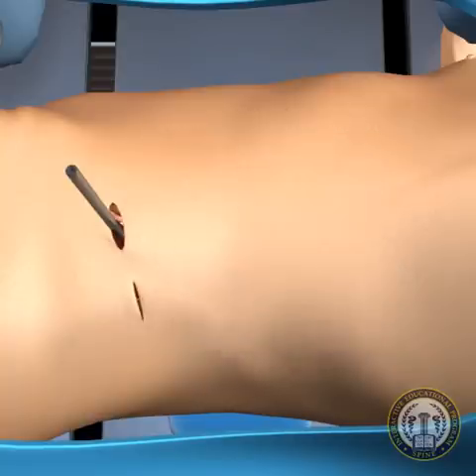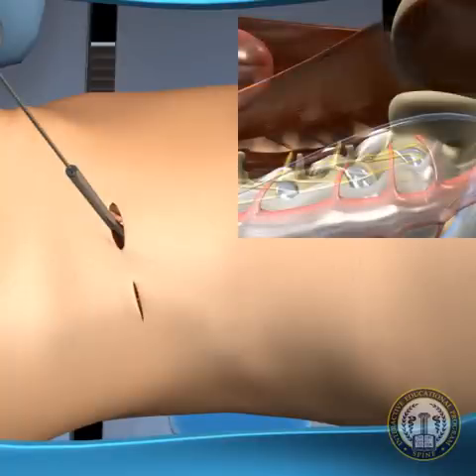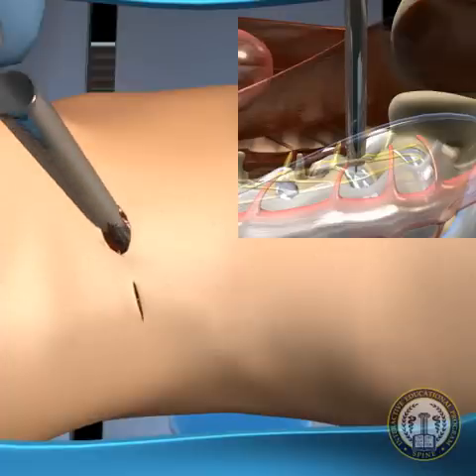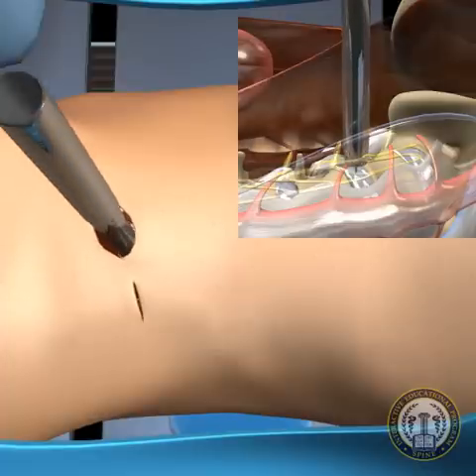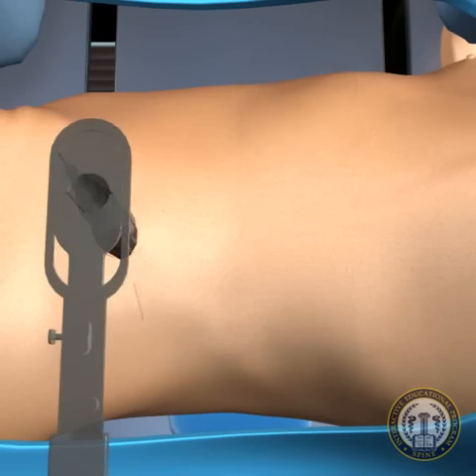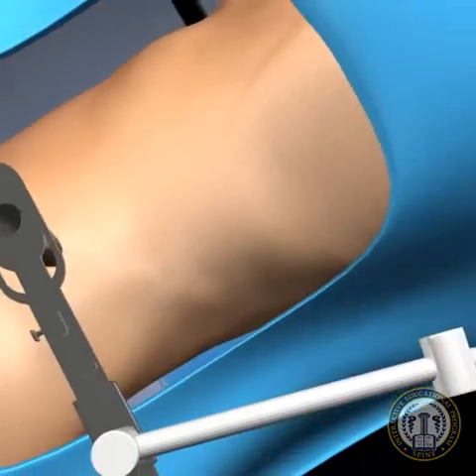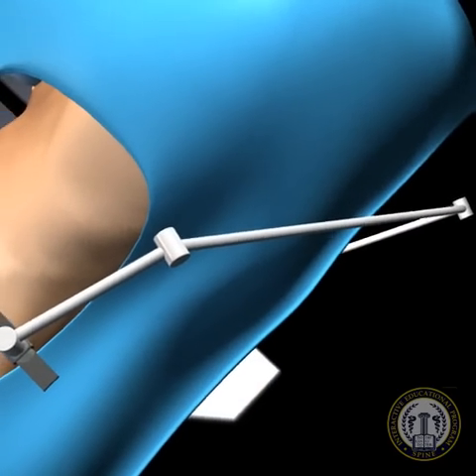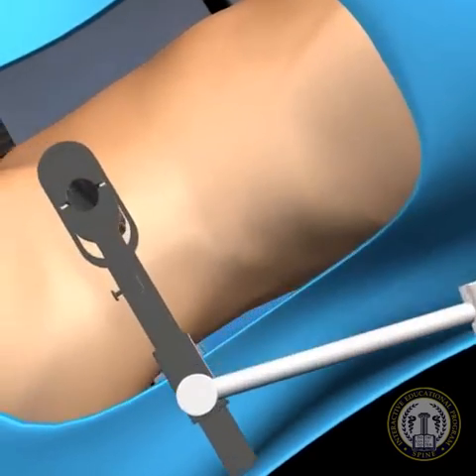Once the dissector is safely on the disc, it is secured to the disc with a guide wire. Dilation cannulas are then utilized to allow the safe placement of a dilation tube retractor. This retractor is secured to a table-mounted arm to minimize intraoperative migration. The discectomy is performed once the tube retractor is opened.